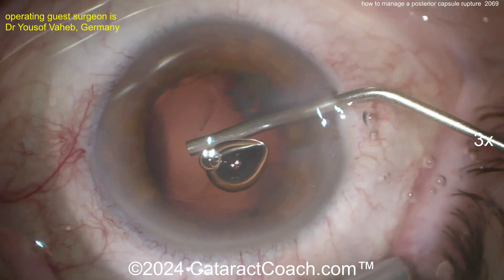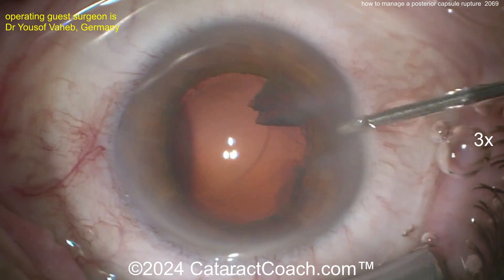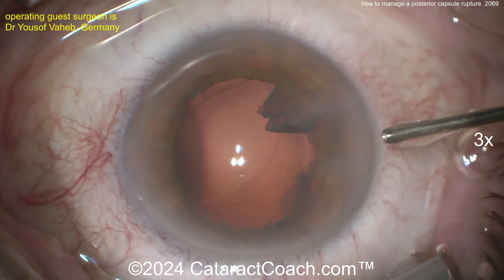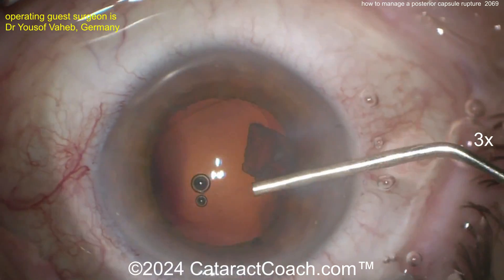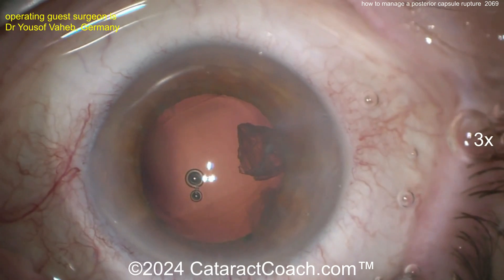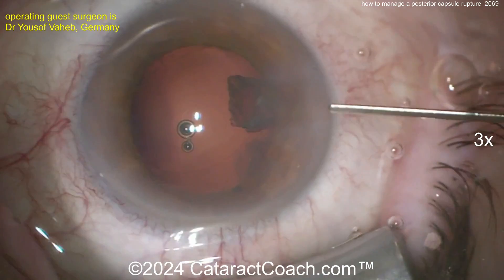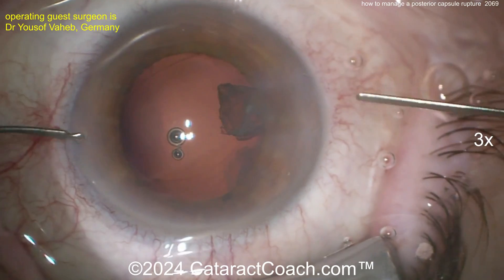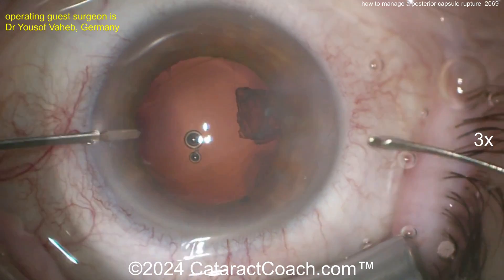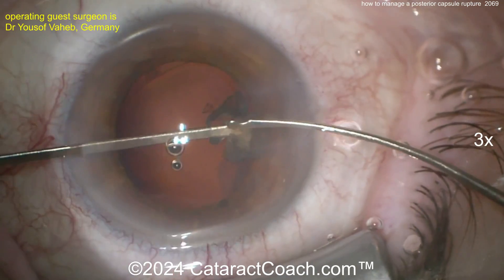There are still a couple of little pieces. I like this idea — try to flush them out. Inject from the opposite paracentesis and then just depress that main incision; you'll be able to get the piece burped out of the eye. There's that piece right at the incision — that's an effective way of doing it. Viscoelastic is cheaper than vitreous, so if you need to put more in, feel free.